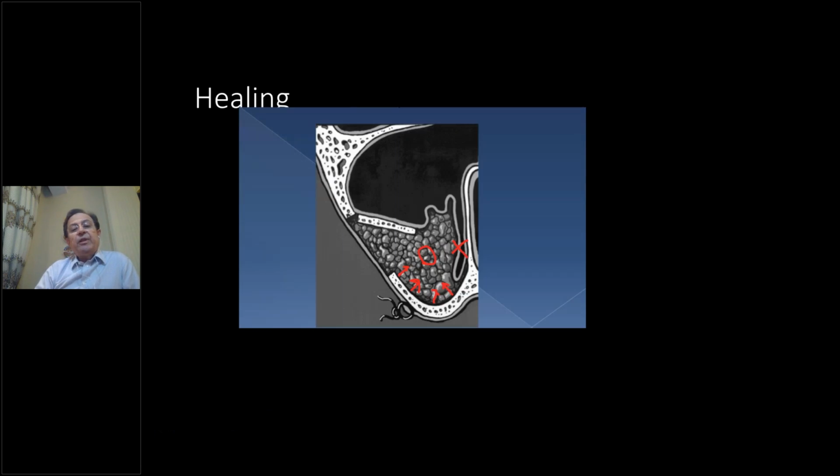How about the healing of the biomaterial? I must tell you that touching the medial wall is necessary and is the main goal, because if we leave the membrane here and push it and fill the sinus, we lose one of our blood supplies, and the formation of bone will decrease.